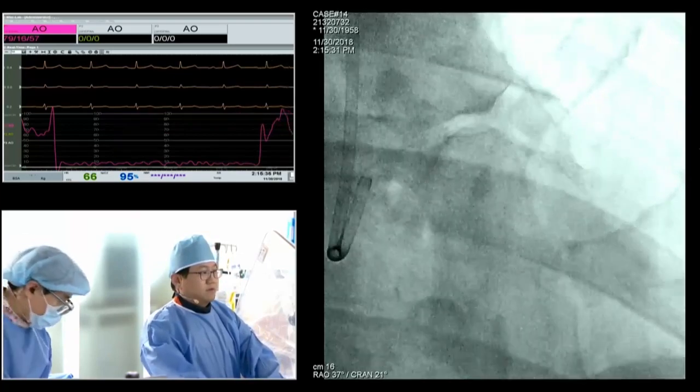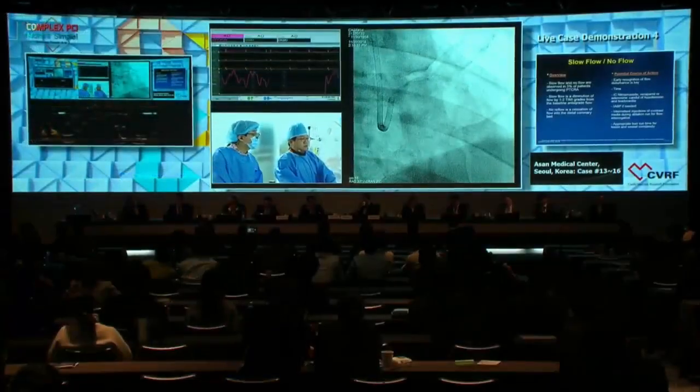All right, we will revisit in a limited time, and so you want to move to the next room. Okay, Dr. Kim.